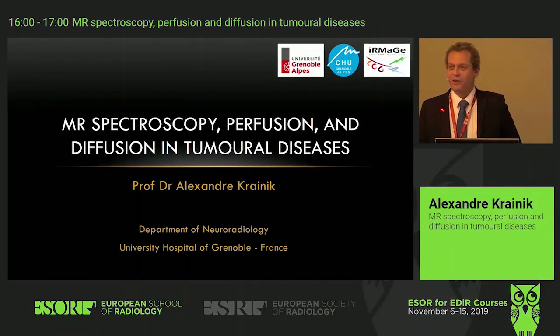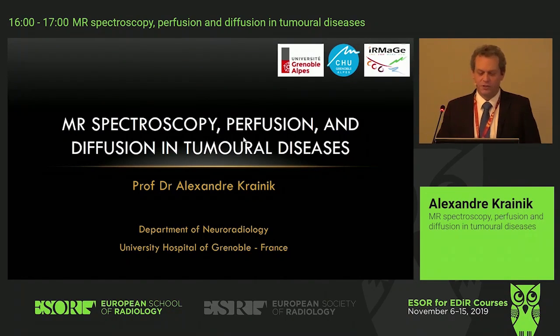Okay, then here we go for our last session of the day. Then we'll deal with tumor and some advanced techniques such as spectroscopy, perfusion, and diffusion imaging.